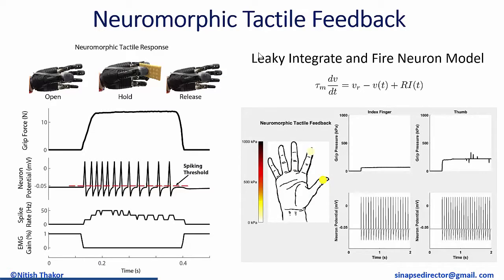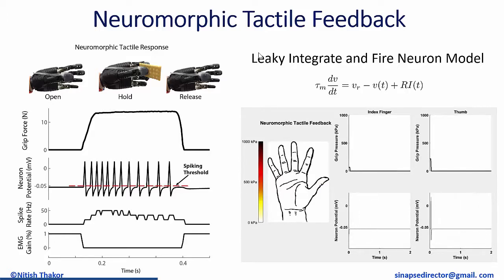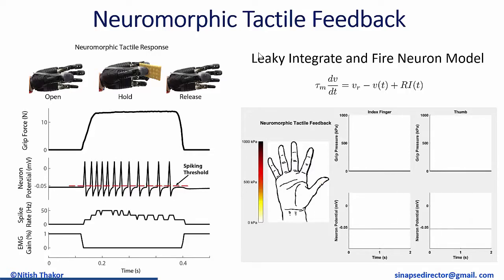Can we get that feeling back? If the amputee touched something, how would that person know and feel what he or she touched? Consider on the left side is the prosthetic hand and you're grabbing an object. Our sensor is going to produce the spikes that you see on the left side. On the right side, what you see is this spiking activity that can now be relayed as electrical stimulation to different locations. So maybe that's one way we can get that feeling back to the amputee. The idea here is to convert the sensor signal into digital spiking activity, and then produce electrical stimulation, which then provides sensory feedback.